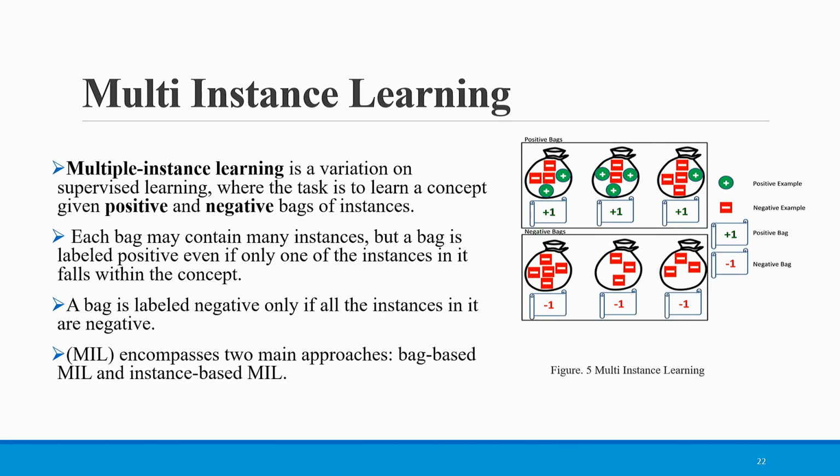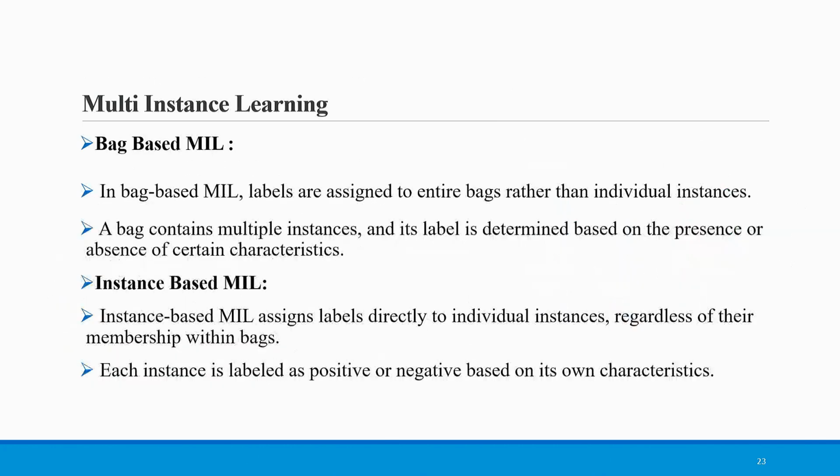So if one instance in the bag is positive, the whole bag is considered positive. If all the instances in the bag are negative, then we consider that bag a negative bag.